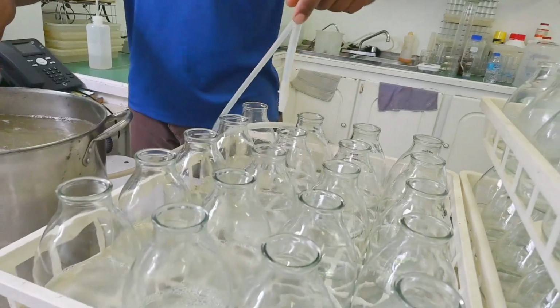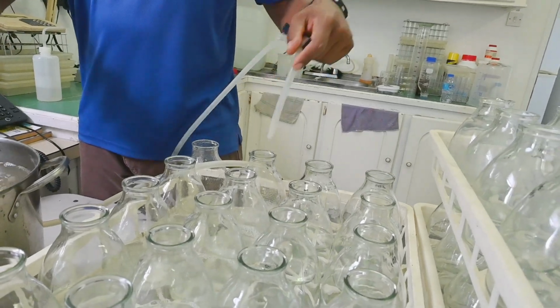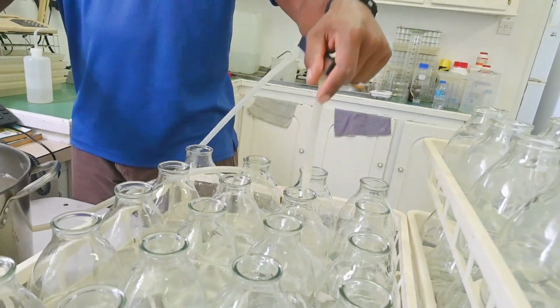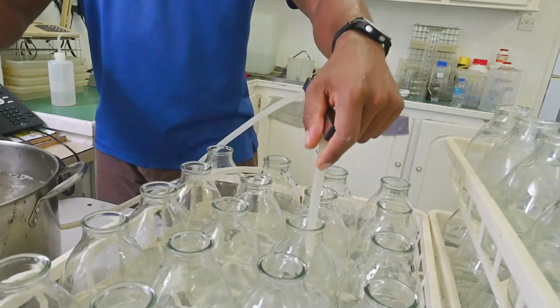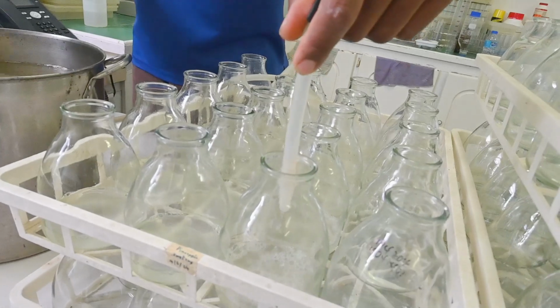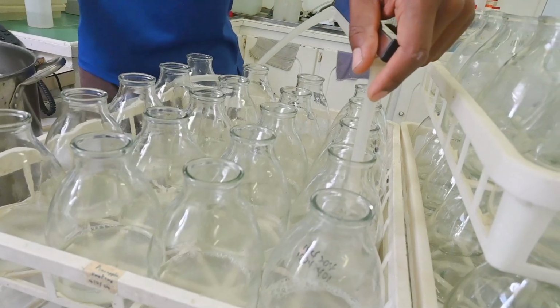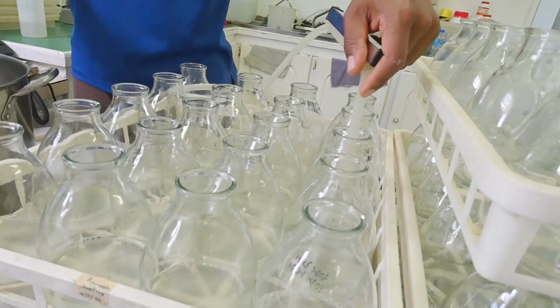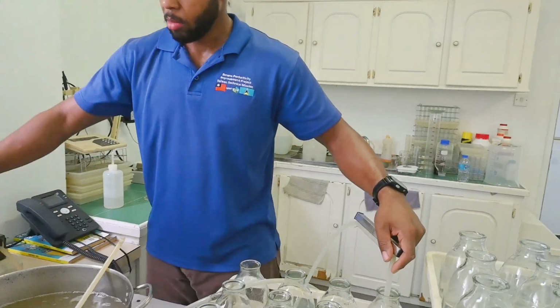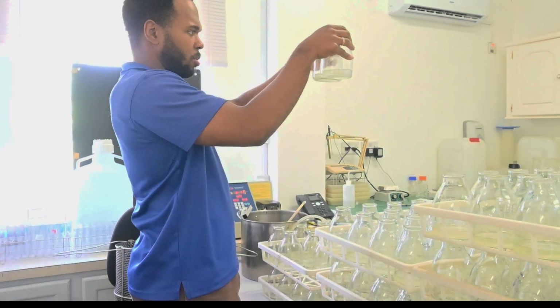It doesn't settle to the bottom of the pan. I've got the same 50 milliliters in each bottle.